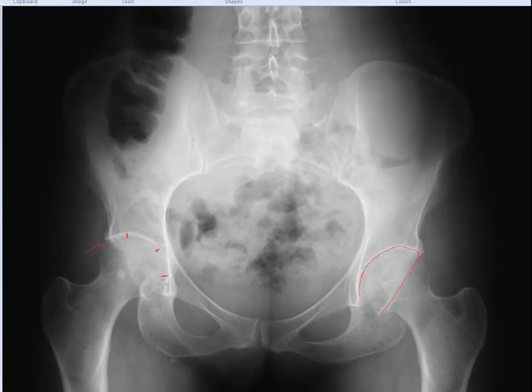It's important to remember that this is a circular joint and during regular degeneration we should only see narrowing of the superior most aspect. Whenever you have circumferential narrowing of the femoral acetabular joint, this is problematic — it can be indicative of inflammatory arthritis like rheumatoid arthritis, but it can also be indicative of more serious conditions like infection. When we get to our pathology tutorials we'll talk more about that.